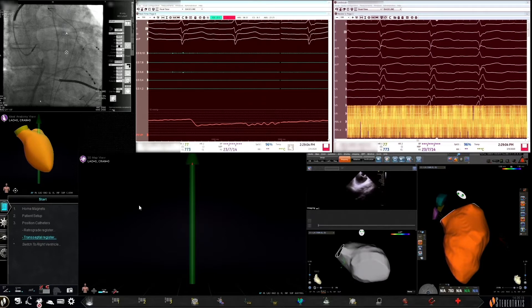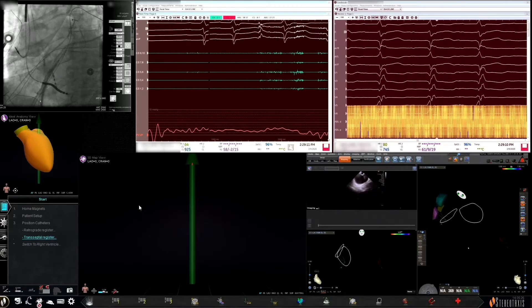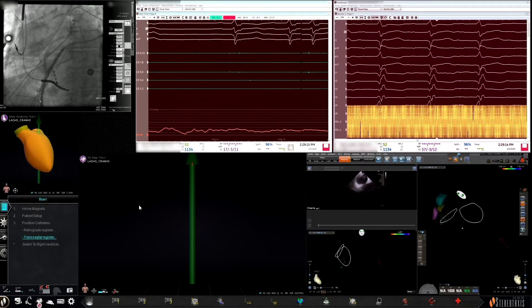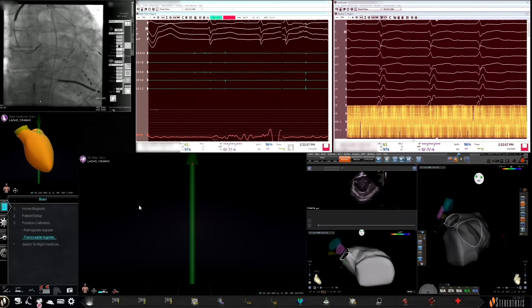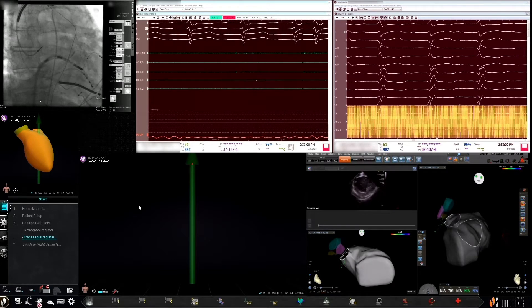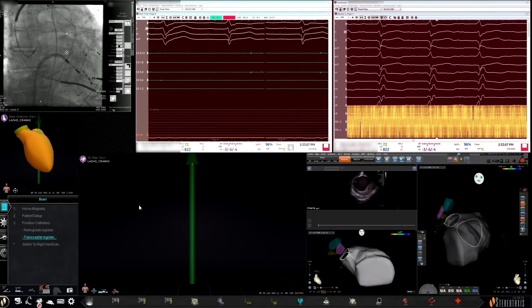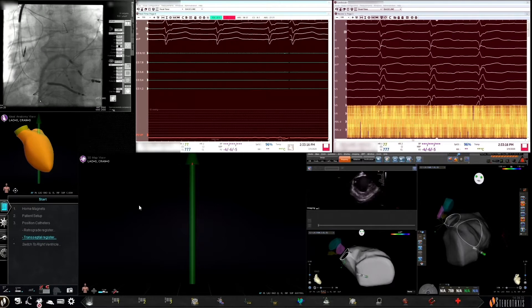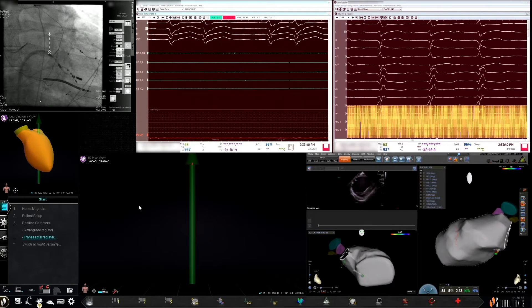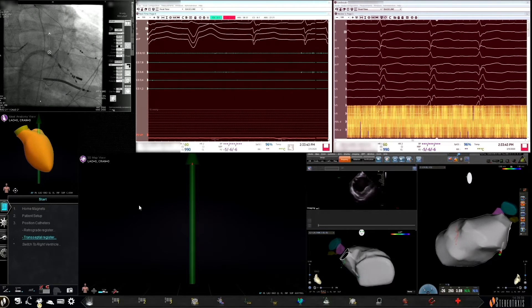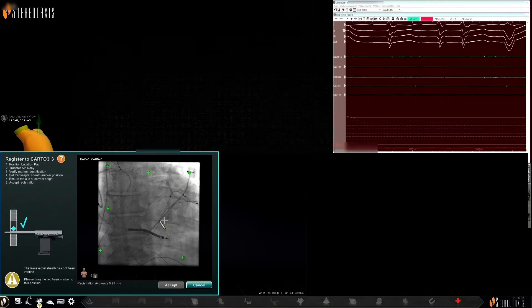In this case, the ultimate transeptal access did tend to be somewhat higher than I would have normally preferred, but with the use of robotic navigation and a robotic ablation catheter, that concern is less so than with a manual catheter. Following this, the sheath is directed in an anterior approach towards the mitral annulus, which is all that is required to engage the RMT catheter into the left ventricle. Prior to mapping, biventricular pacing was turned off so that the patient would be in their native conduction, and the ability to map late potentials is not obscured by biventricular pacing.